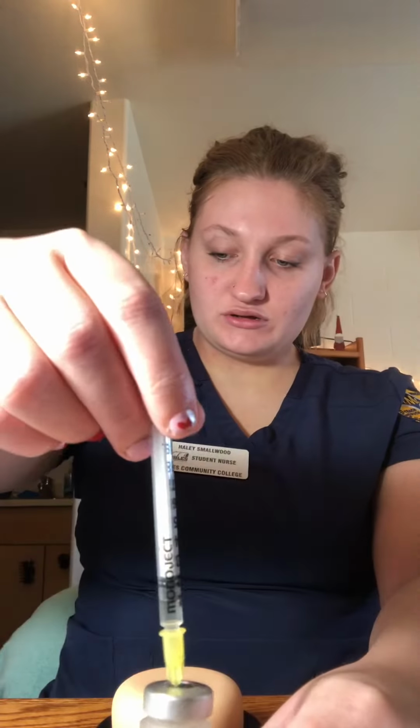And you don't want any air bubbles. And then you can double check you got the right amount. And then to recap the needle, you want to use one hand.